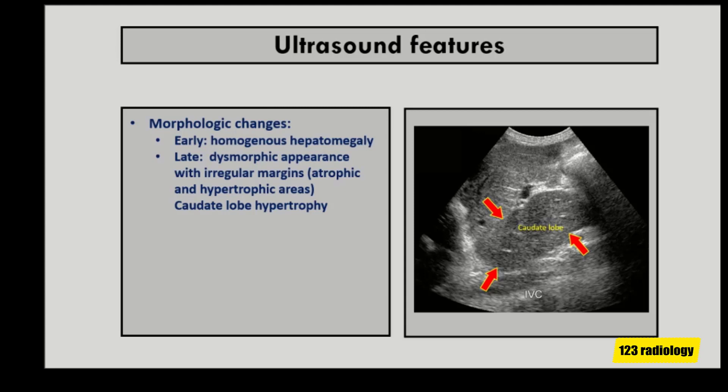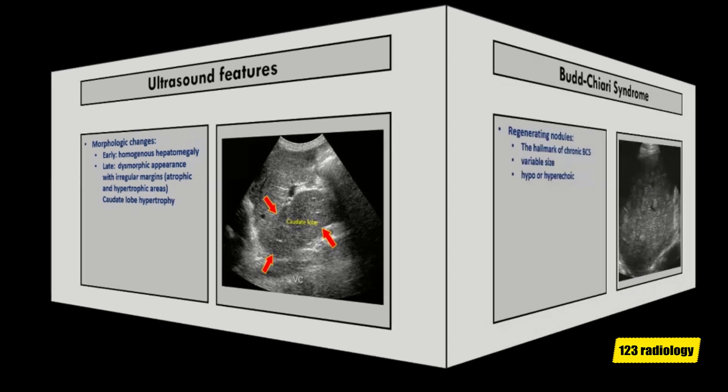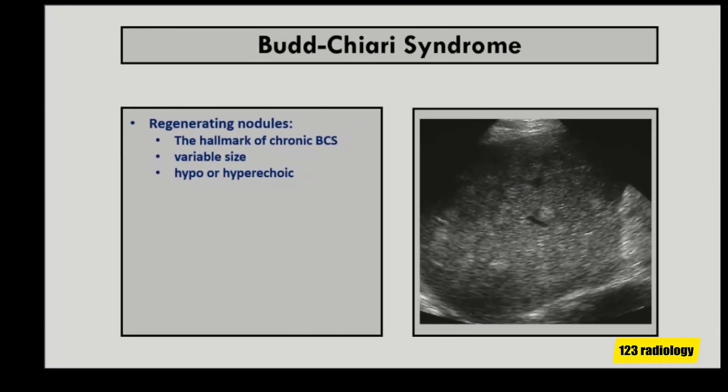Caudate lobe hypertrophy is a frequently noted morphological sign in Budd-Chiari syndrome. Regenerating nodules are the hallmark of chronic Budd-Chiari syndrome. They are commonly multiple and variable in size. On ultrasound, regenerating nodules may be hypo- or hyperechoic, as seen on this image.